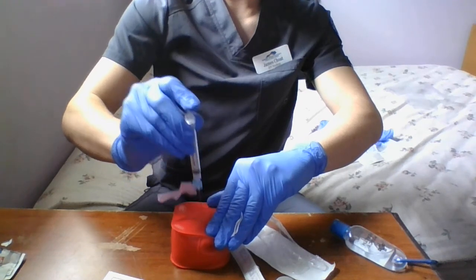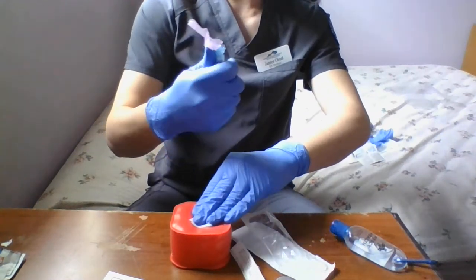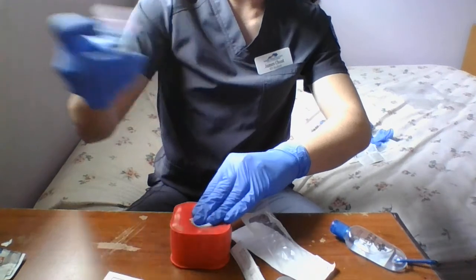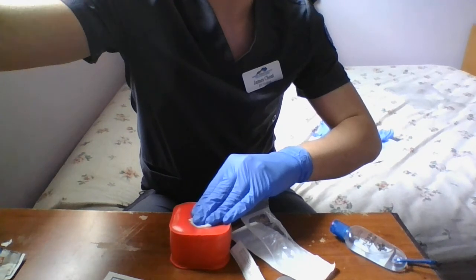After you've injected it, you can pull the needle out straight. You're going to apply pressure with the gauze, and then you're going to engage the safety. There's no way that needle is shown. And I'm going to dispose of it in my sharps container.